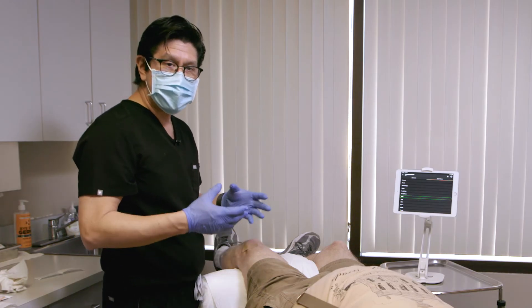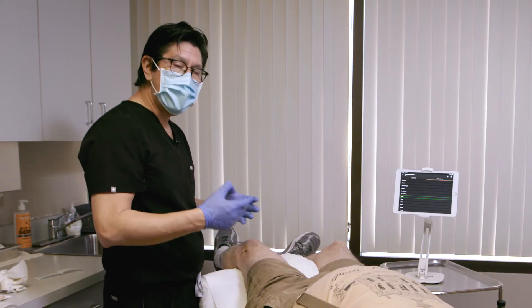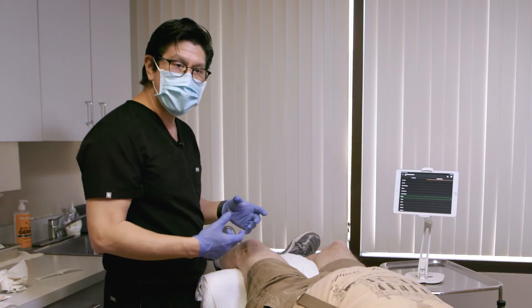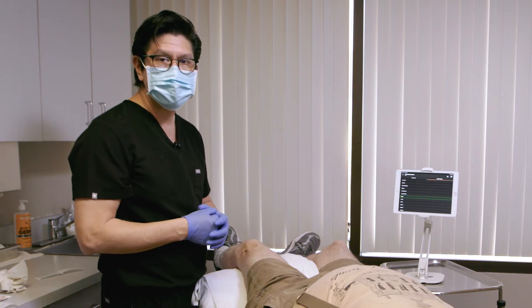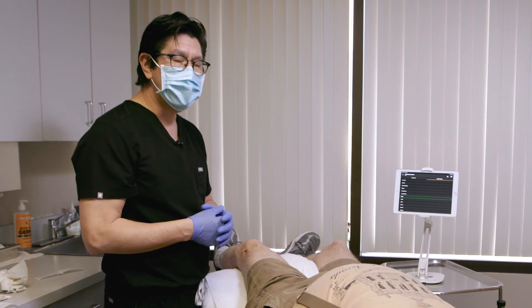For the most part, if you get to the right spot and get in the joint, it really doesn't hurt. So that's why you always ask the patient how they feel — if he's hurting, you might not be in the exact spot. You might need to pull back a little to make sure you're in the joint. He had a little bit of pain on initial injection, so I pulled back, got in the joint easily, and then I was able to flow nice and easily. It's a combination of being able to see and of course talk to your patient, but this helps us treat our patients much, much better.